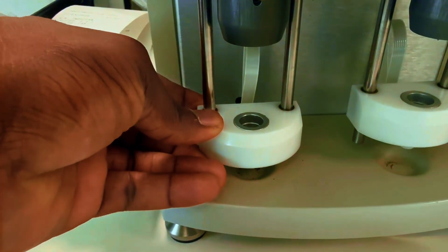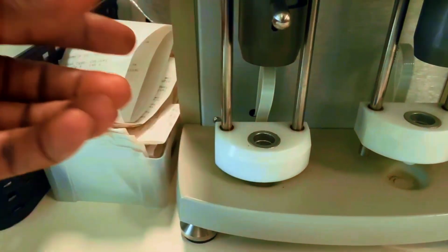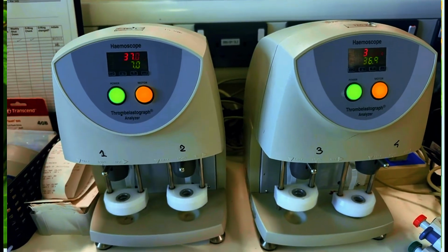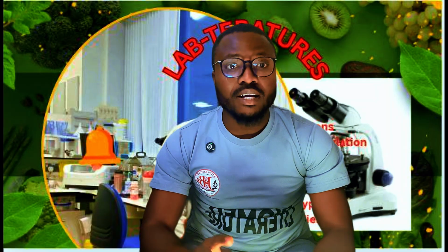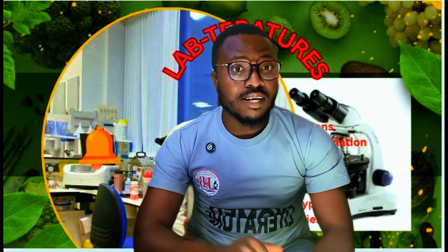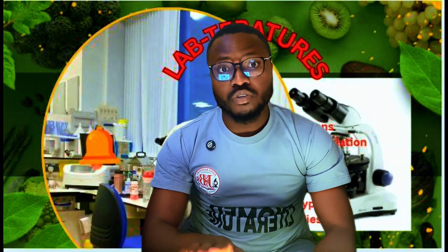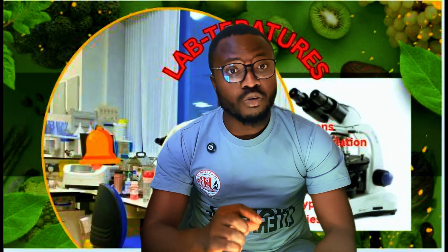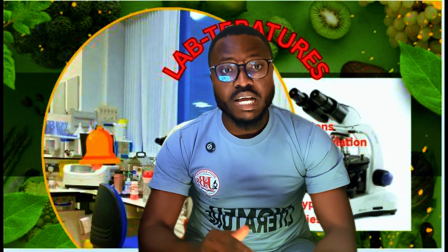What I'm going to do today is to explain some very important clinical stuff and relate them to practical things. I'm going to introduce you to a few analyzers and how they work. The topics that we're going to treat today are the hemophilias A, B, and C. I'm going to explain the different types of von Willebrand disease as well. There are three analyzers that I'm going to introduce you to: the rotational thromboelastogram, which is the ROTEM, the thromboelastography analyzer, called the TEG analyzer, and the last one is the platelet function assay, which is the PFA analyzer.